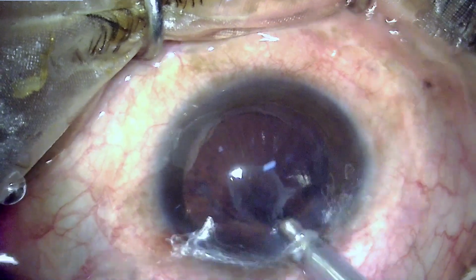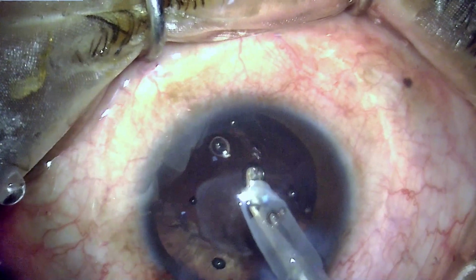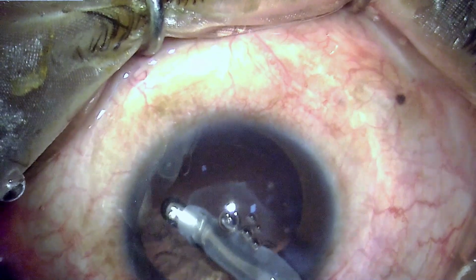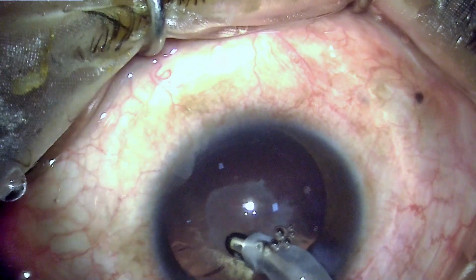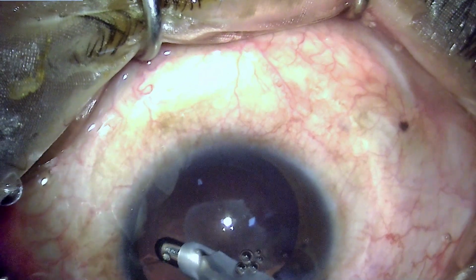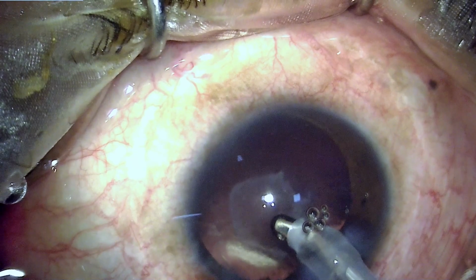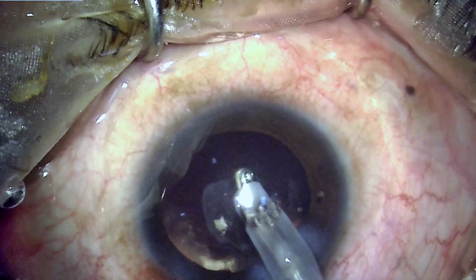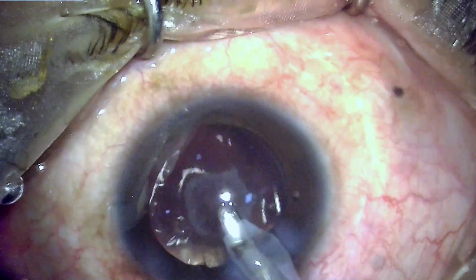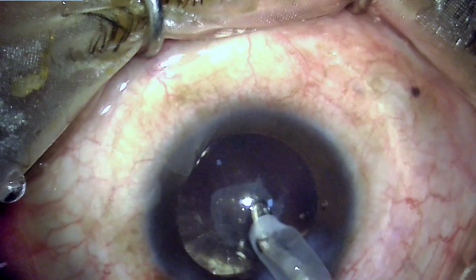Silicone oil prolapsing into the anterior chamber is a nuisance, and once it happens, the oil keeps on coming continuously, because once it has found a passage, given the normal gravity and the kind of density the oil and water have, the oil has a natural tendency to come up.